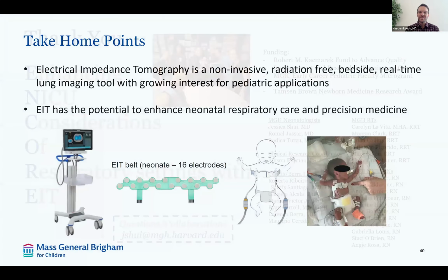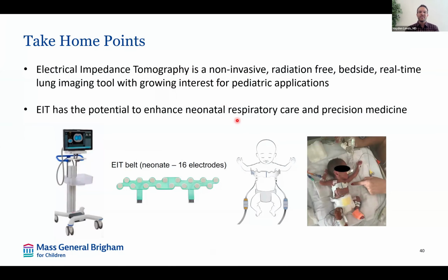Thank you so much, Jessica. That was a great presentation, and I think it really highlighted the utility of EIT, especially as this bedside tool, where you really focused on trends over time, and on specific patients where each patient is their own control. How can we monitor them without having to take them to a CT scanner, or see the physiology in real time? I know in our own unit, that's been the most helpful utility of EIT: seeing that physiology play out at the bedside while we can make adjustments and see the effect, whether it be PEEP titration or now the new added advantages of this pulsatility and perfusion studies.